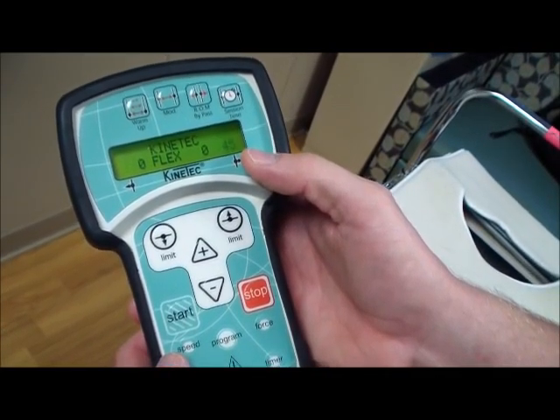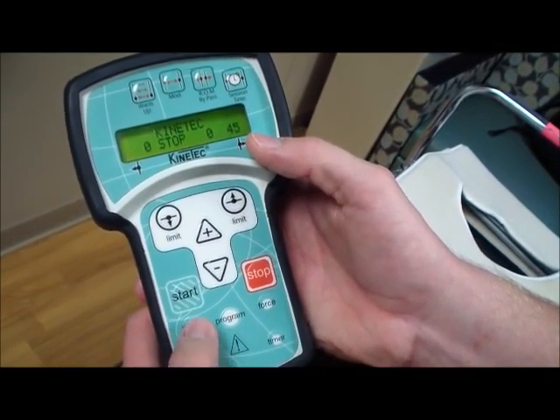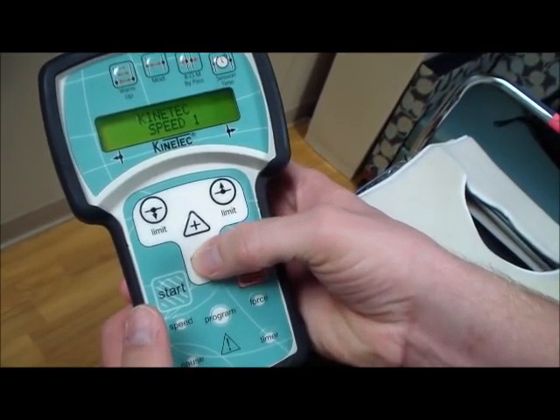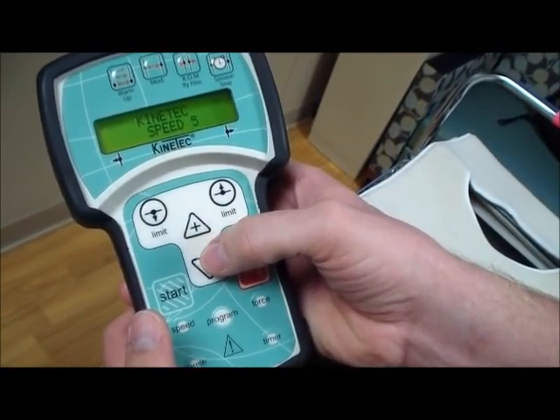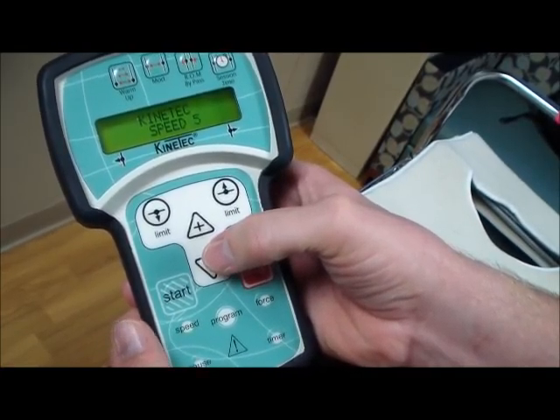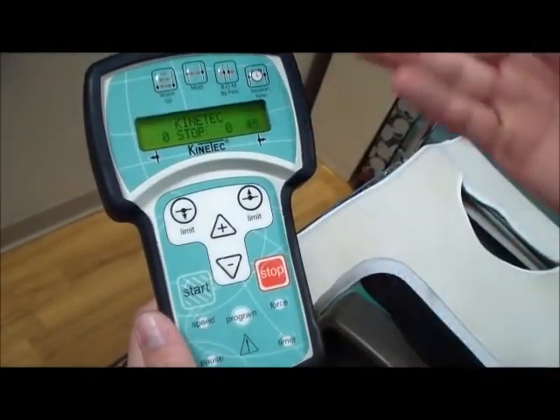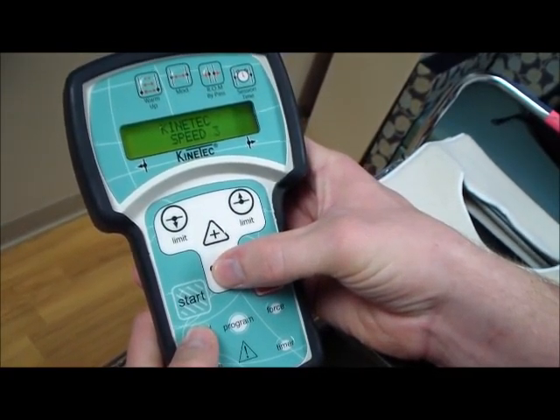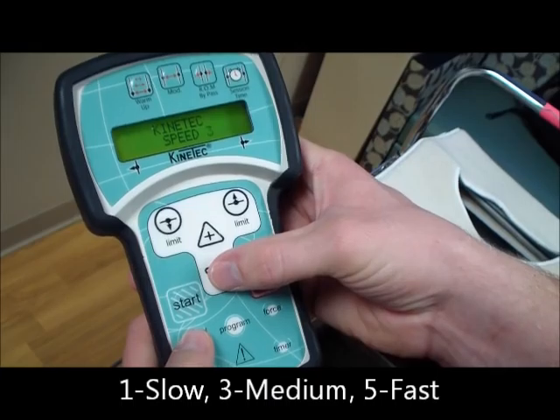After that, we'll adjust the speed as well. So the speed button here, just like the other buttons, we're just going to click once, and the speed goes between 1 to 5, and this is how many times it goes through its cycle per minute. So right now we're at 5. We want to bring it down to our medium speed, so it goes through 3 cycles per minute.